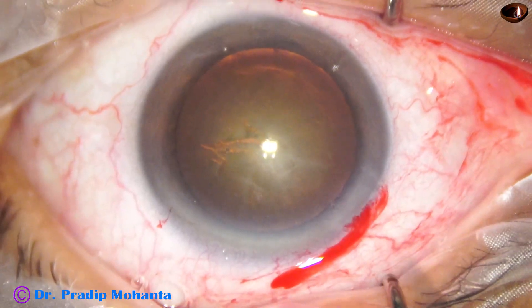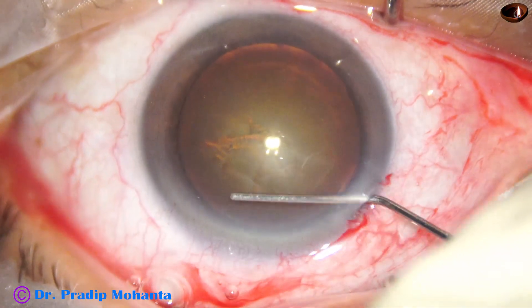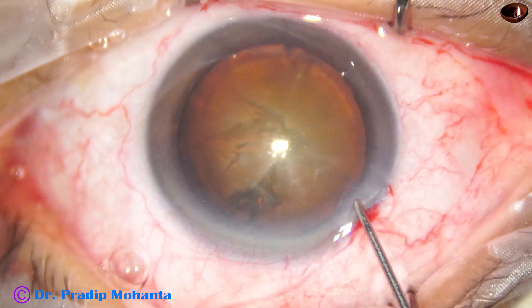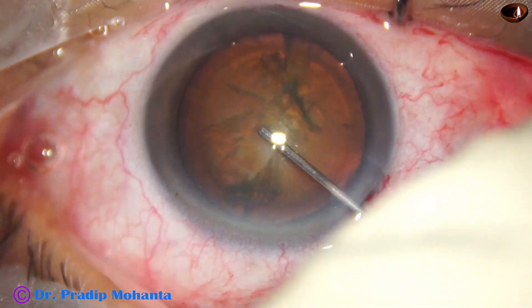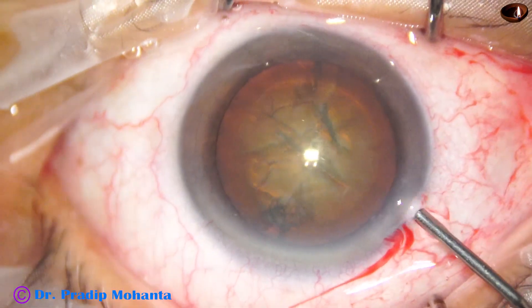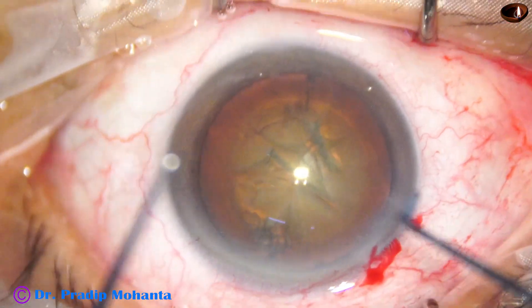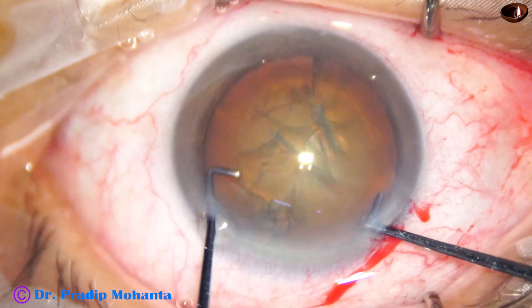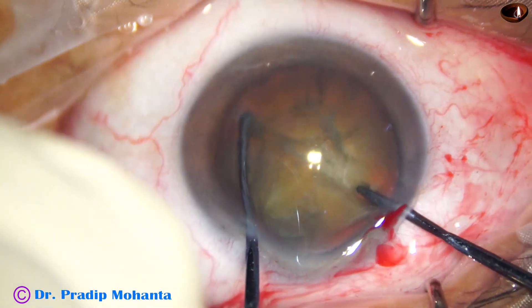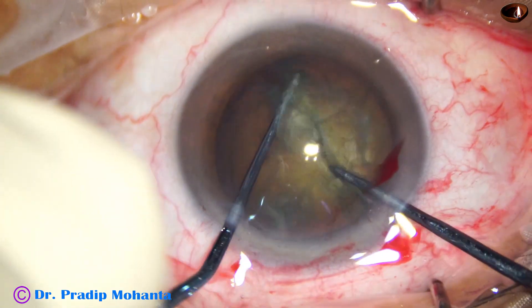Hydrodissection is done with the help of BSS and a 27 gauge cannula. The nucleus is tapped, and visco is again filling up the anterior chamber. Now watch the use of the pre-chopper — the pre-chopper and the nucleus sustainer divides the nucleus into two pieces.